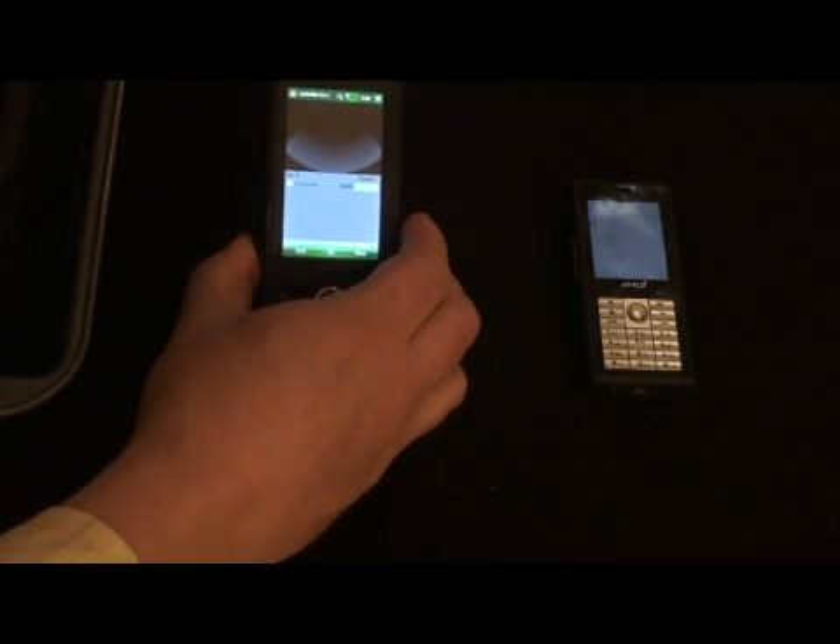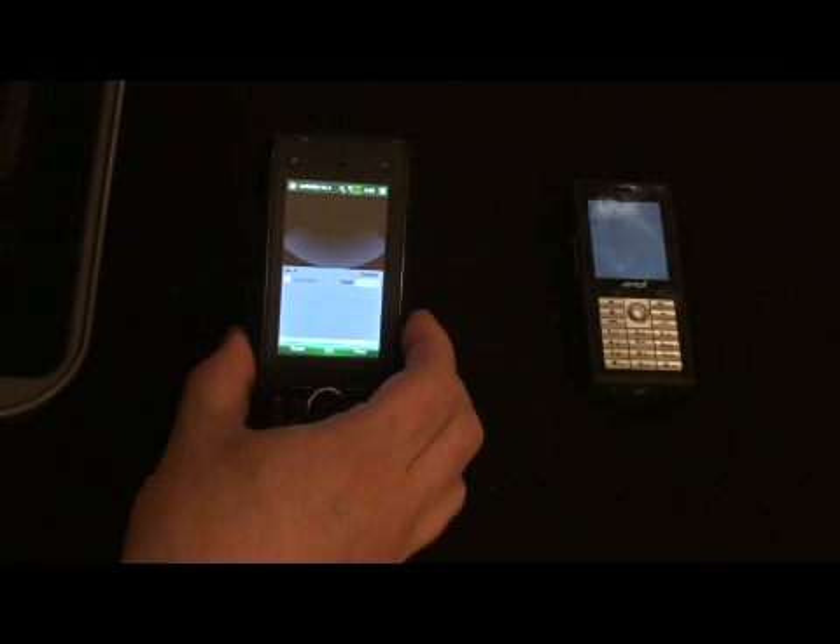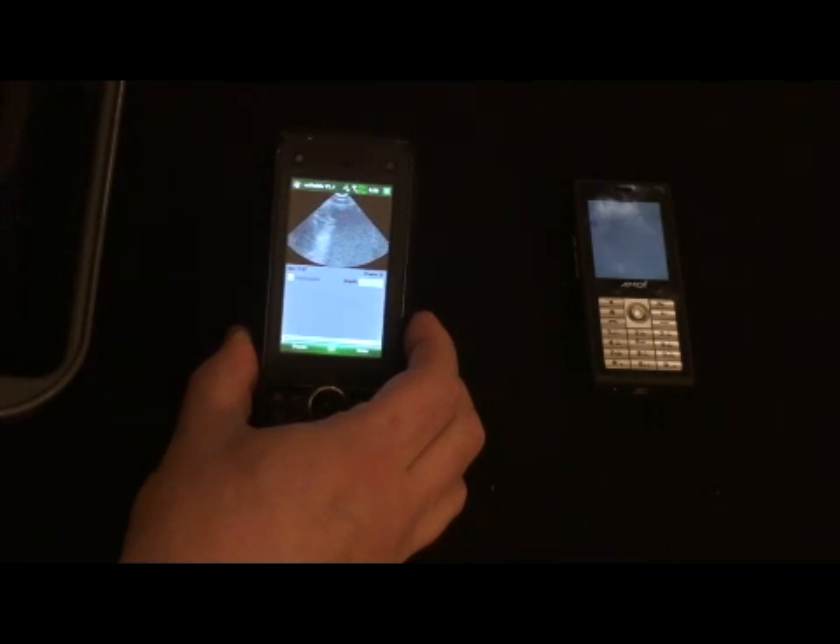Here's the application running on the phone. As I turn the probe on, the probe is now running — you can see that the image has changed. Now I'm scanning just a tissue-mimicking phantom here, and I know the image isn't too great at the moment. I'll zoom in in a moment.